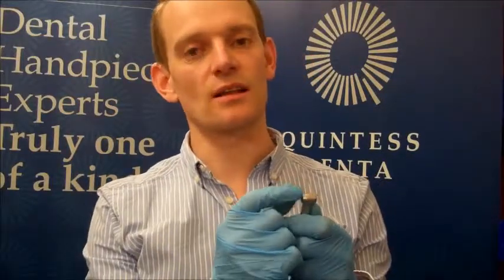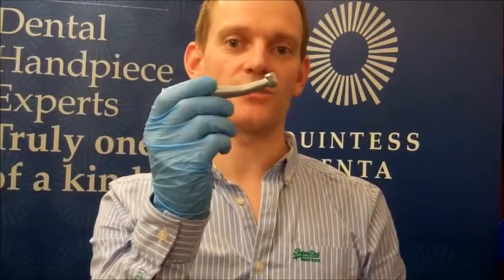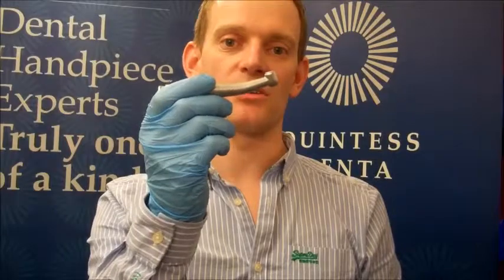If that is unsuccessful, you will have to send the handpiece in, because there are lots of little O-rings fitted inside the head. Those can become flattened and become frayed, and that can also block the ports. So you might have no option but to send it in for repair. So that's how easy it is to lubricate your handpiece. If you're doing that regularly, and say after every use and doing the chuck once a week, your handpiece should be lasting at least 12 months before having to come in for repair.